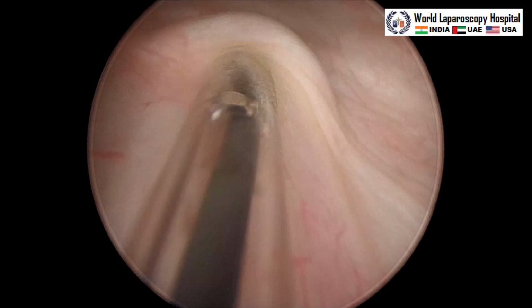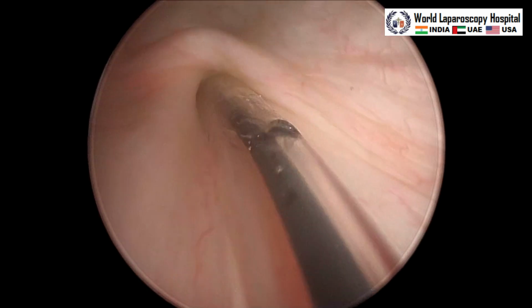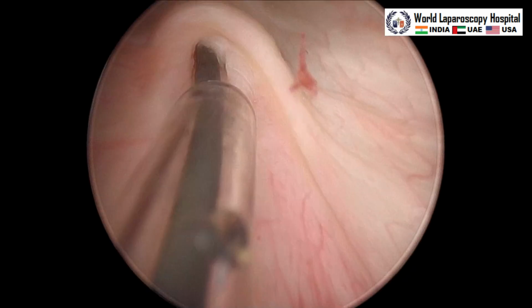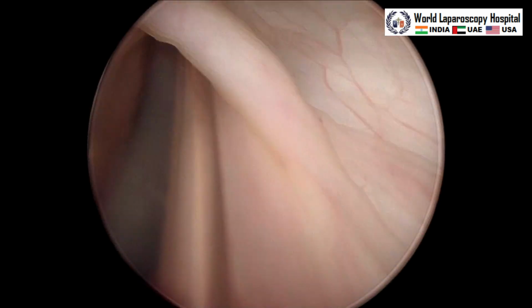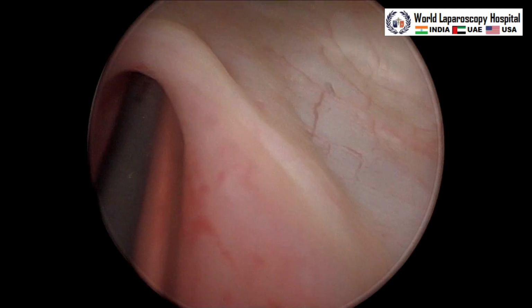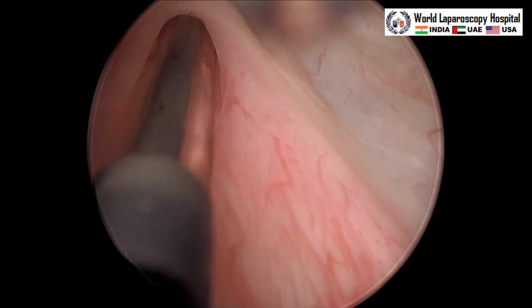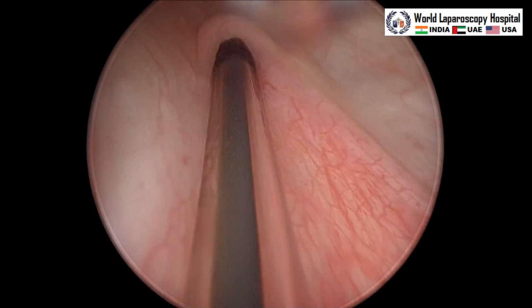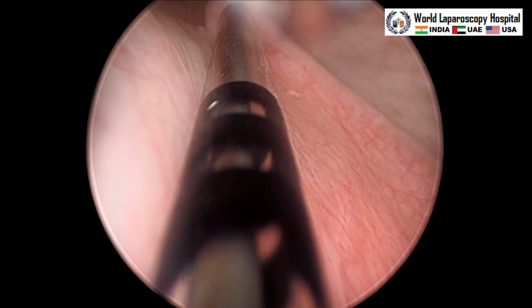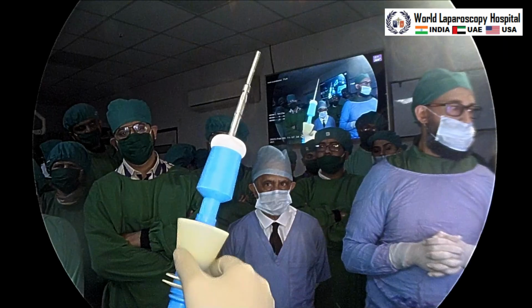will go, and this is the right ureteric catheter which will get catheterized. So this is the ureteric orifice. A little bit of rotation is sometimes required to dilate the ureteric orifice, and then the 6 French transparent ureteric catheter is introduced into the right ureter, and again we will go up to the 3 thick line so that 15 centimeter will be calculated. This is 10 centimeter, and now this is 15 centimeter. So it is over. Now we will take it out and we will start.